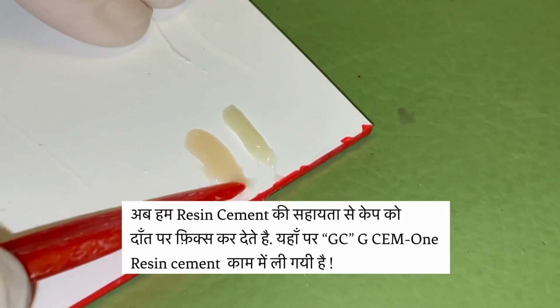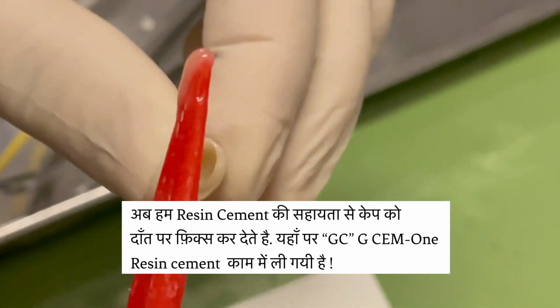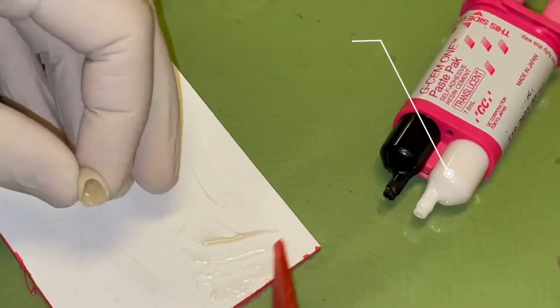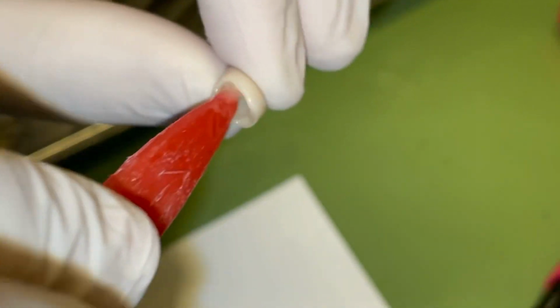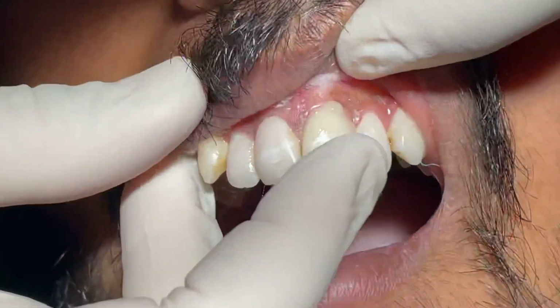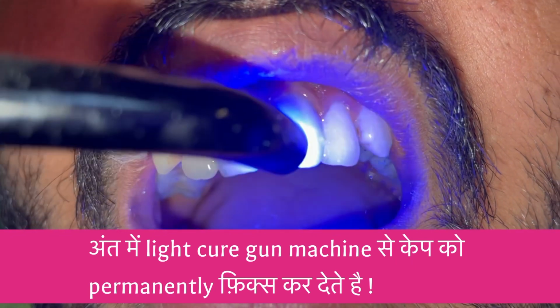And here comes the fixing material which is used for the fixation of the crown. Here we are using light cure resin cement, which is GC G-Cem, and this is one of the topmost resin cements available in the market today and accepted worldwide. Now the cap is filled with the resin cement and placed on the tooth surface. The excess material is removed and we cure it with the light cure gun. This light cure gun emits light rays, which fix the cap permanently to the tooth surface in a couple of seconds.